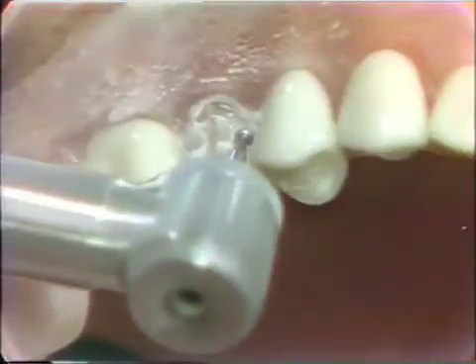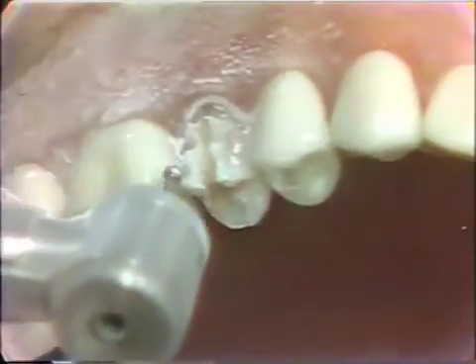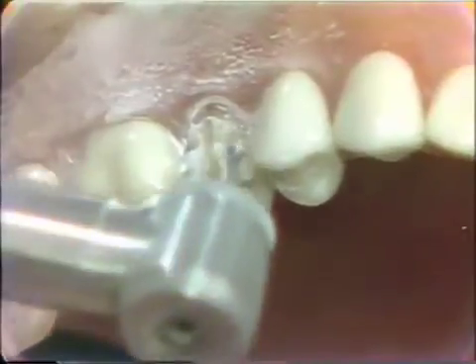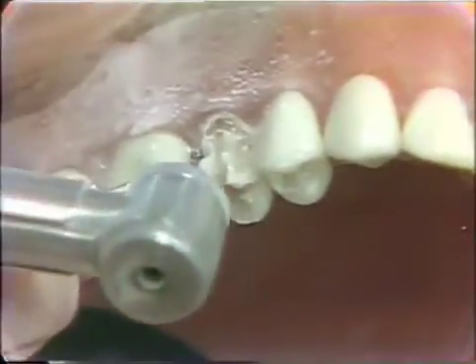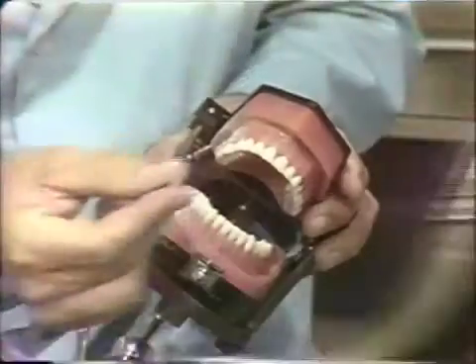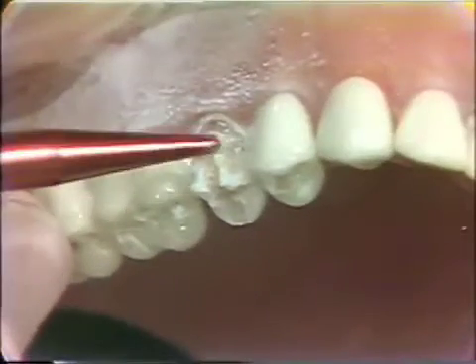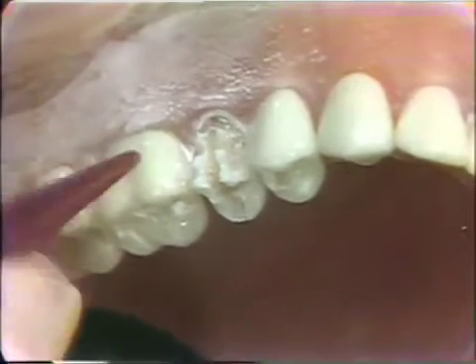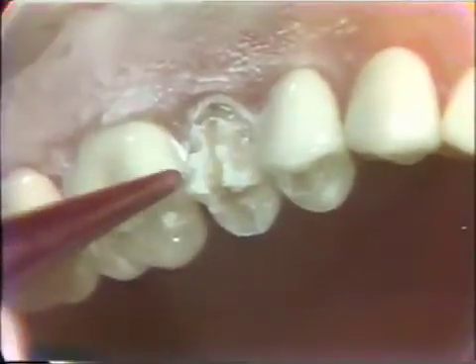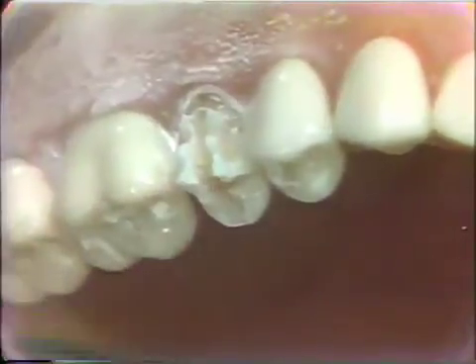Care must be taken not to disturb the adjacent tooth. Now we will change to a 770-7 diamond and remove the small islands of enamel that are left. This will duplicate the curvature on the labial surface and give us approximately a millimeter and a half of reduction on the labial surface, and approximately two millimeters of reduction on the occlusal surface.